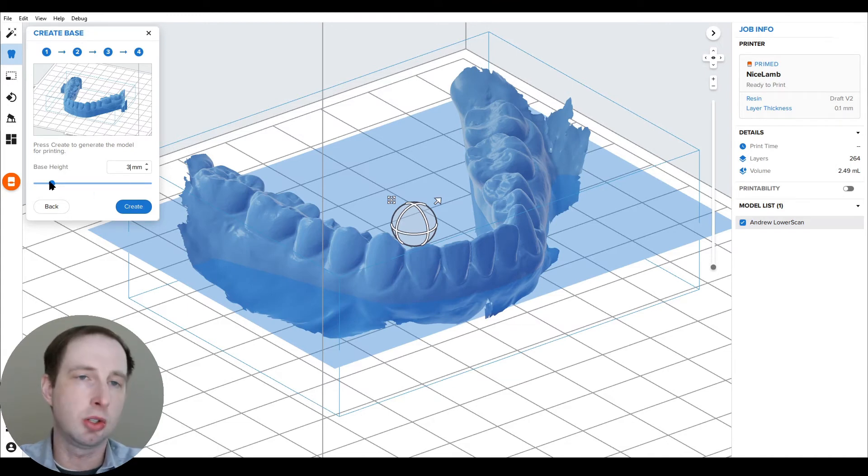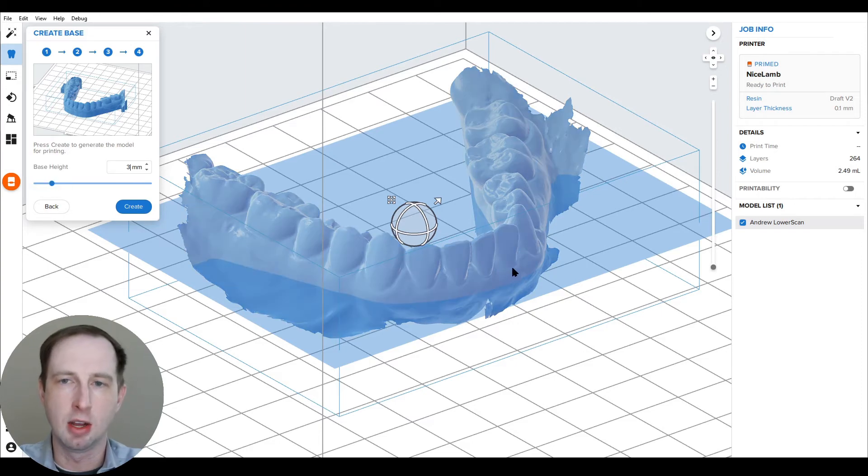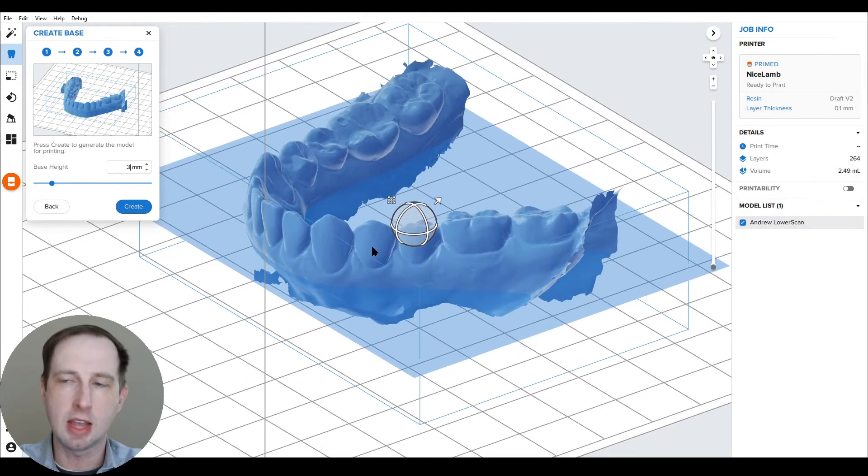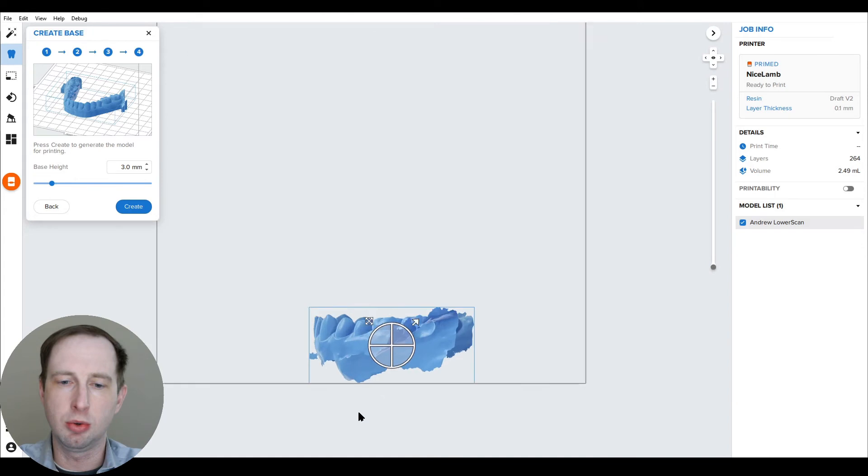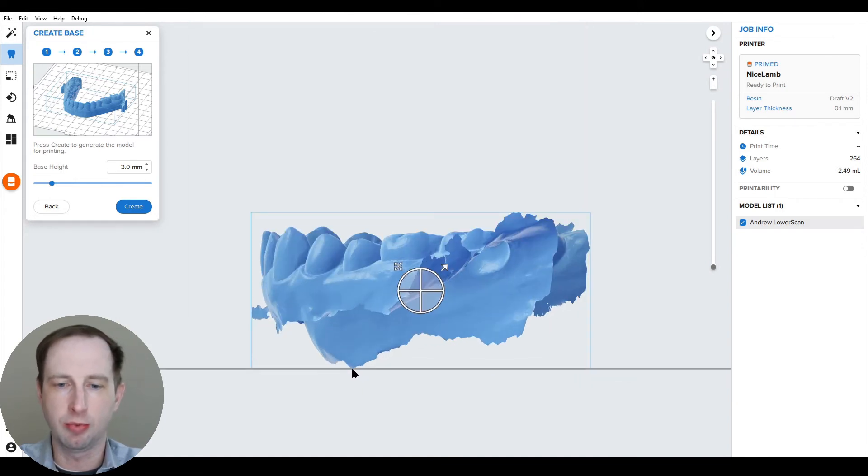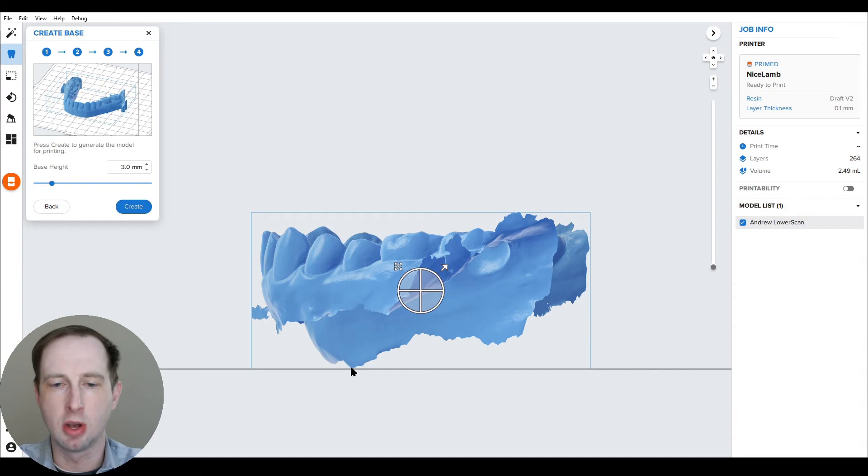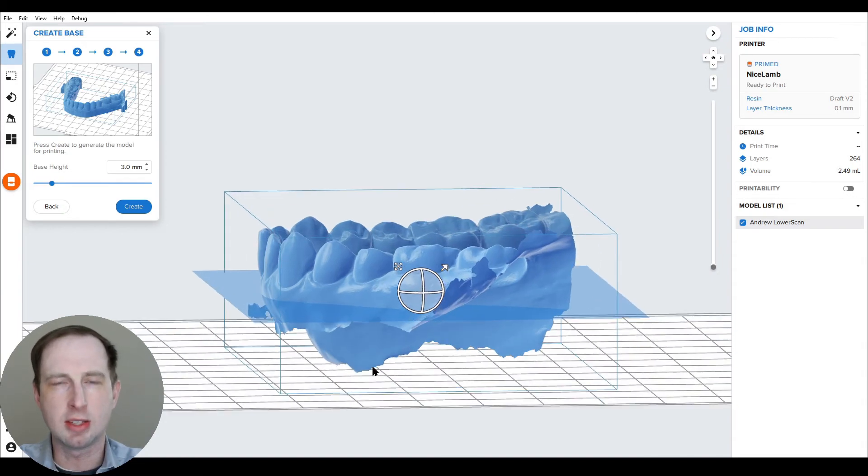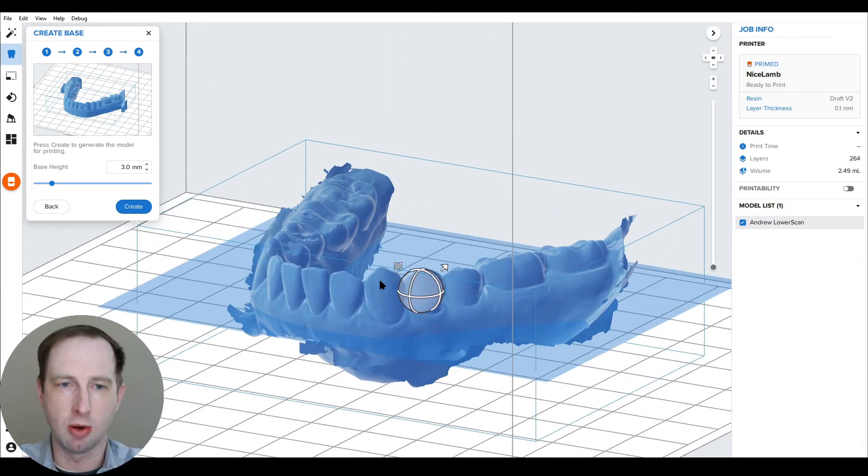If you didn't use the plane tool to trim any of the scan surface away, it's going to be from the lowest part of your scan. So for this, if you go to side view, you can clearly see the lowest part is touching the build platform here. So it's going to apply three millimeters from here down. That's important for doing palatal models as well.